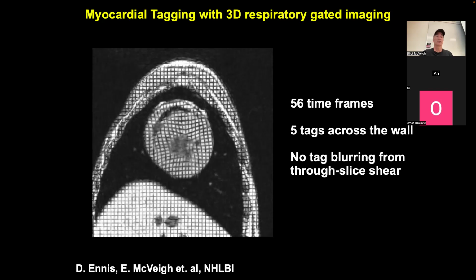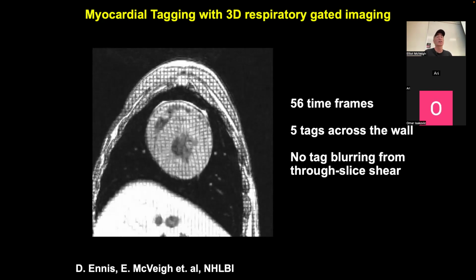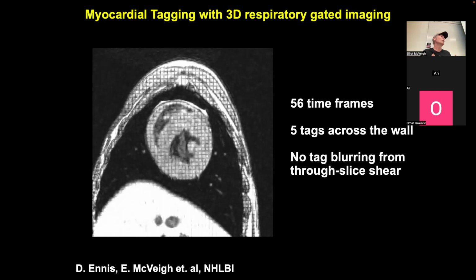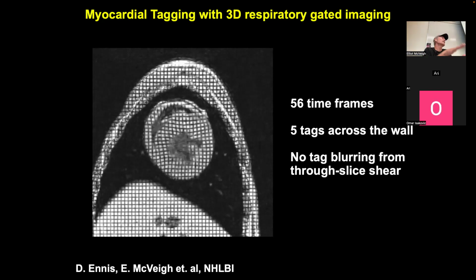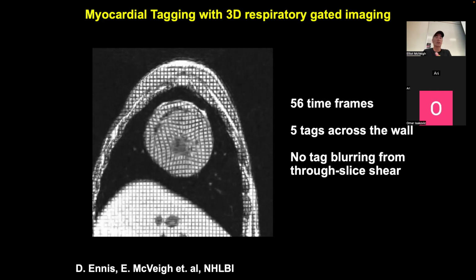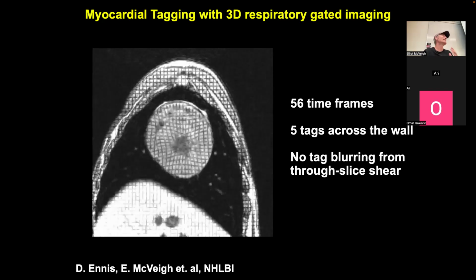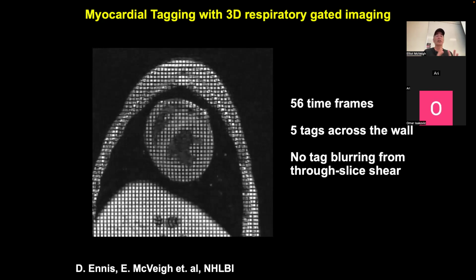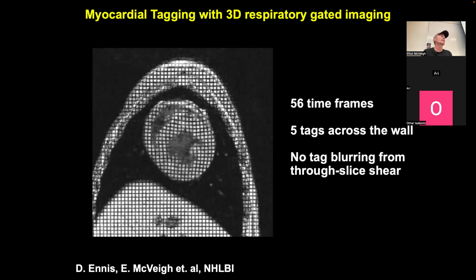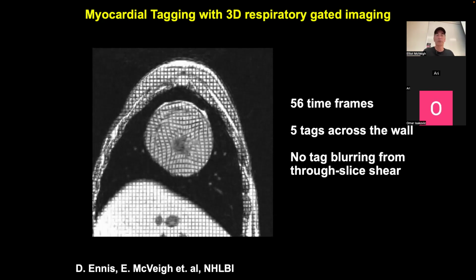And you get this ridiculously high spatial resolution map of myocardial strain, right? And to do this in humans would be very hard, because you would need to have them breathe very regularly, and you would need to gate on their breathing as well as their EKG in order to get resolution like this. I'm not saying it can't be done, but it would take some special effort, right? But in looking at myocardial strain and experimental technique, this is obviously a ridiculously good standard for measuring strain. So we'll stop there.